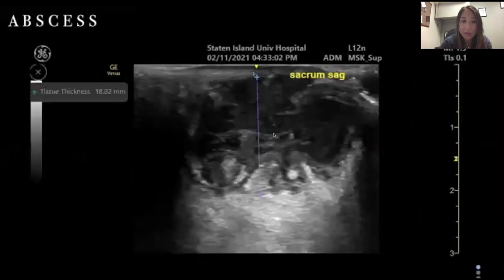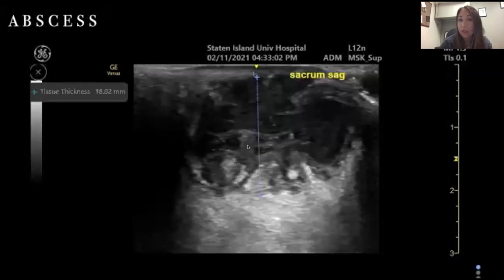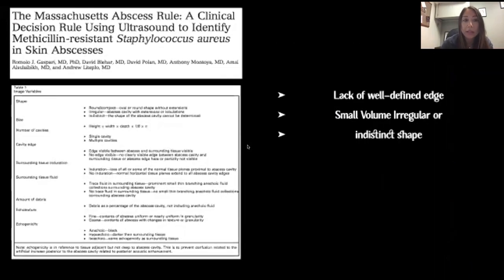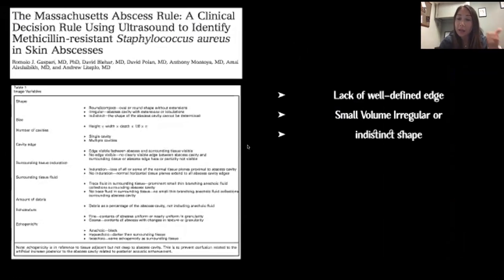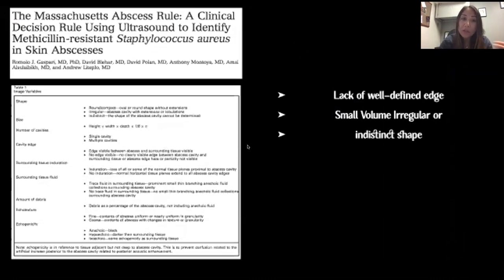We often use the Massachusetts abscess rule, which is a clinical decision rule using ultrasound to identify MRSA. Higher probability of MRSA is associated with lack of well-defined edges, smaller volume, and irregular or indistinctly shaped abscesses. These are helpful tools to determine what antibiotics to prescribe after draining an abscess.